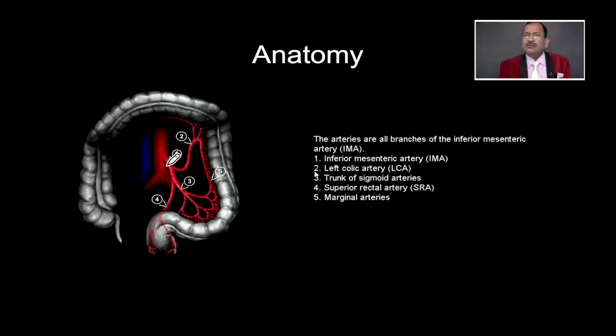You don't need to go to the root of the mesentery and aorta, because you don't need to remove the mesentery. In sigmoiditis, Crohn's disease, ulcerative colitis, the mesentery doesn't have a problem. So you can directly start coagulating, going medial and lateral, by the ligature directly.